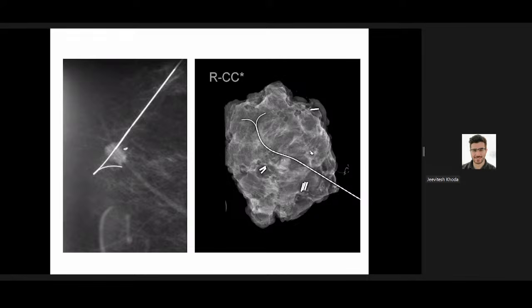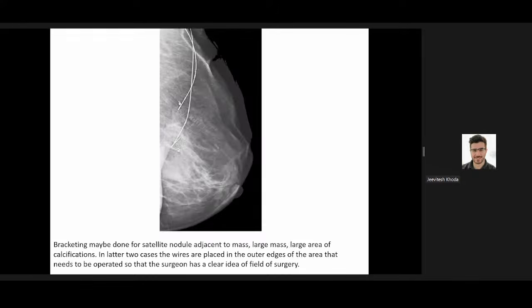Usually, we take a post wire insertion mammographic check image, and if there's any significant displacement, we usually call up the surgeon to let him or her know, and we give an approximate centimeter distance of the wire tip from the marker. Not very ideal, but that is the best we can do rather than keeping the surgeon completely unaware of the situation.